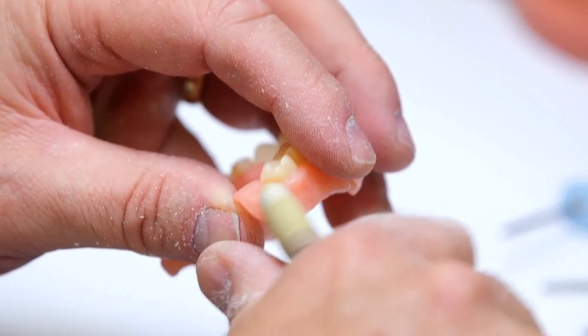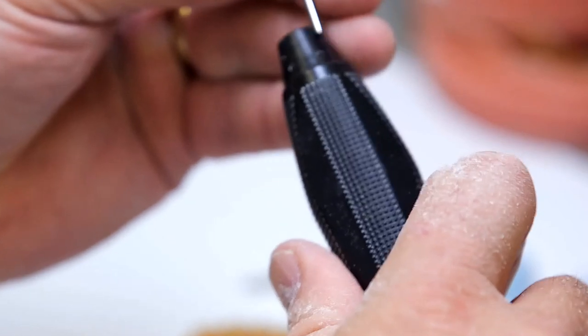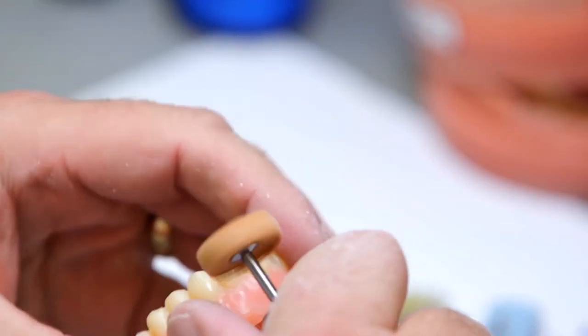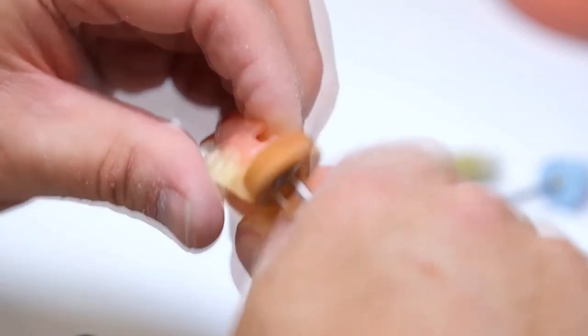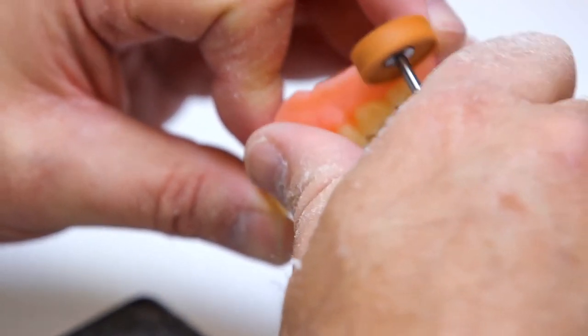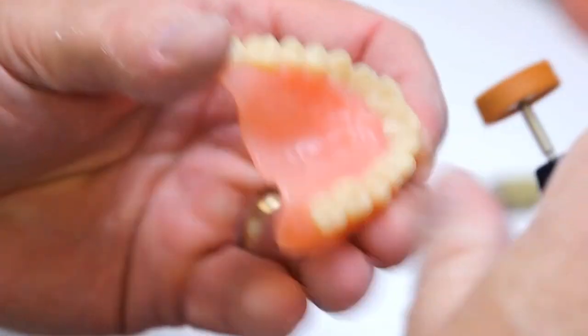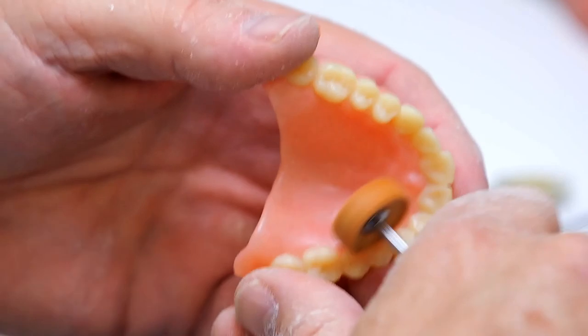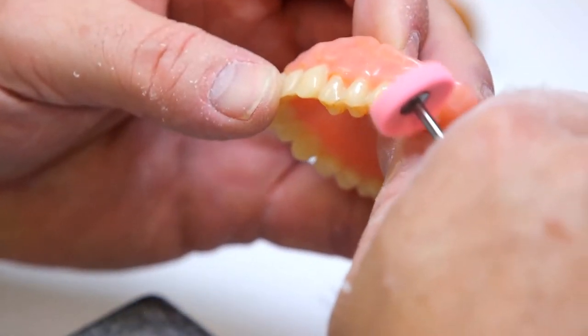Then I'll follow it up with a finer one, just to provide a little bit more of a high shine surface on there. Now, Brassler has a couple different polishing wheels that are impregnated with a polishing medium. This brown one's a little coarser, so you can just lightly go over the surface, and you can see how fast this is polishing up. Again, I'll just stick here on the patient's left side. Shouldn't have to spend a whole lot of time on the teeth other than opening embrasures. So you can see how that's bringing it up to a lightly polished surface. Same thing on the lingual. So we'll start to see a little bit more of a higher shine come out with the pink. You see how nice those teeth start to pop.